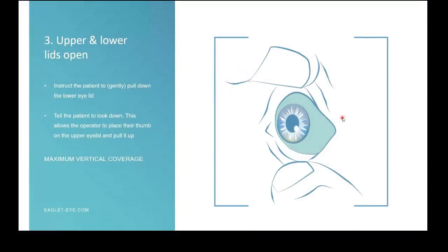I told this already, but how we instruct it to do it is, you pull down the eyelashes, so really grab the eyelashes and pull down the eyelid and use the orbital bone to hold the eyelashes. At that moment, you're not pressing on the eyeball, so it's not sensitive, not painful for the patient. And the same way you can do it, opening the superior eyelid, and then you have enough room to measure the 20 millimeters.